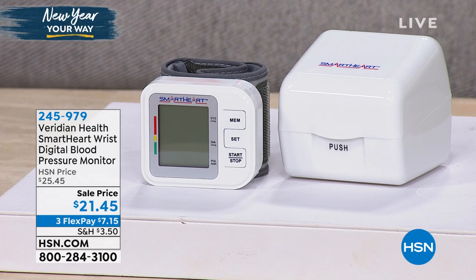This will fit a 5 and 3/8 to an 8 and 1/2 inch wrist. It requires two AAA batteries, which we are including today, and we're even including that perfect little carry case. I'm going to let the guy that knows the information tell you about this product — he is actually a registered nurse.